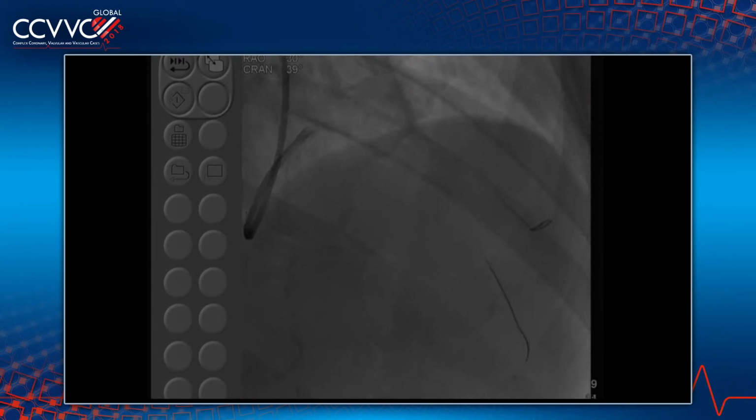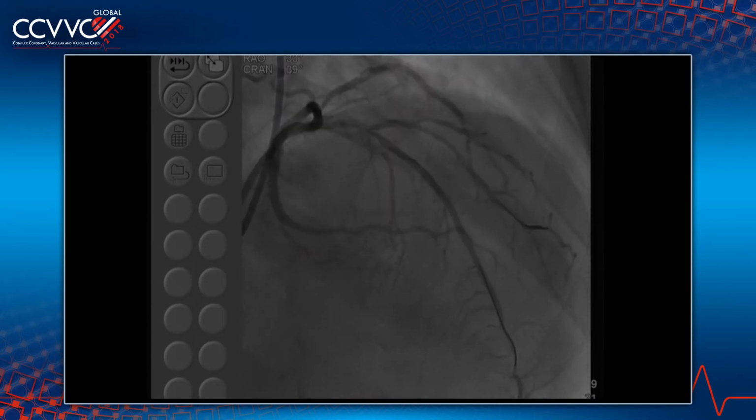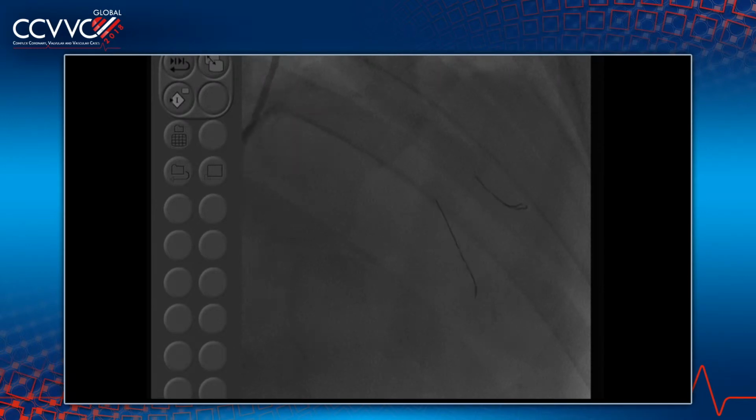And you think the DK crush is advantageous because of where your wire goes through and better stent coverage at the ostium? Yeah. And plus, the chance of going through the stent struts while you're doing the final kissing dilatation is higher when you do a DK crush. One important point they already discussed is recrossing is definitely higher when you do DK crush, because you already crushed it, then recross and open the struts of the side branch.